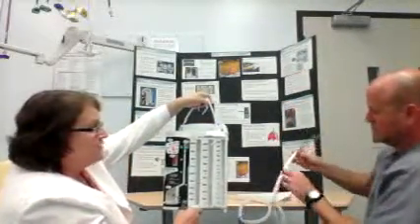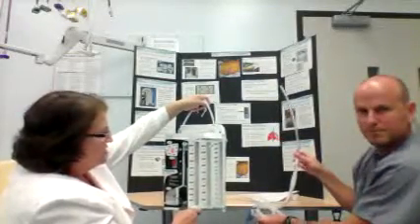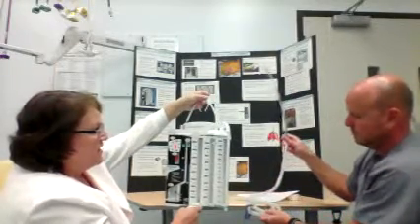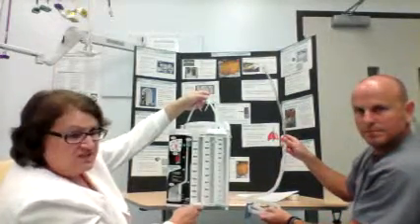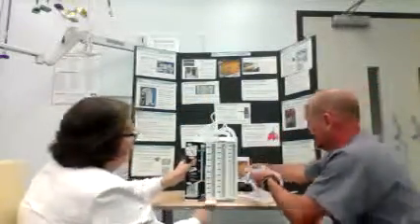We recommend that you follow what your agency policy or your processes are, but I always suggest that you use the hangers and hang it on the bed. That way when people accidentally bump into it, it doesn't fall over. Also, make sure your tubing is not coiled, kinked, or anything like that.